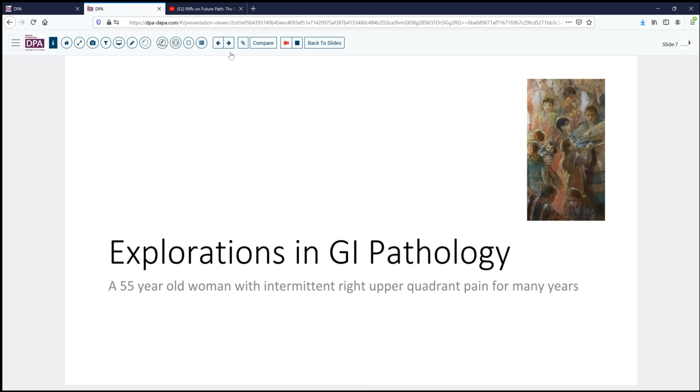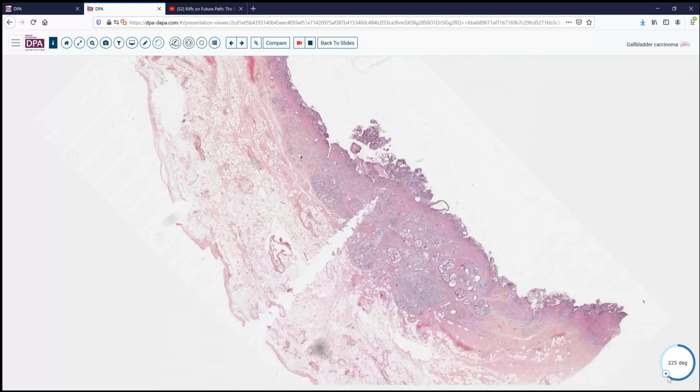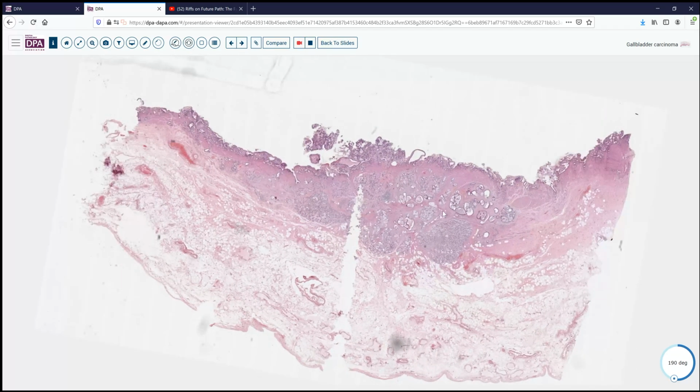However, unlike most gallbladder surgeries, this case had some complicating twists, and the very astute outside pathologist noted an area of mural thickening in the wall, and this he sampled very appropriately, and here we see a representation of this section. Let's just turn it around here so we can look at it right side, top to bottom. As you can see, we have the muscular wall here, which is slightly thickened by some sort of a mixed epithelial proliferation here. And then we have a fatty serosa here.